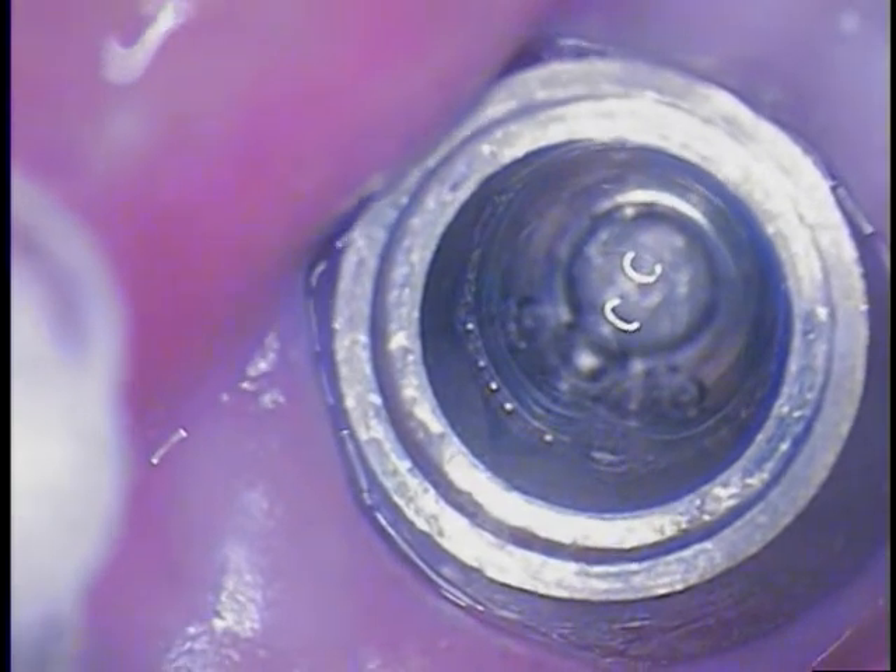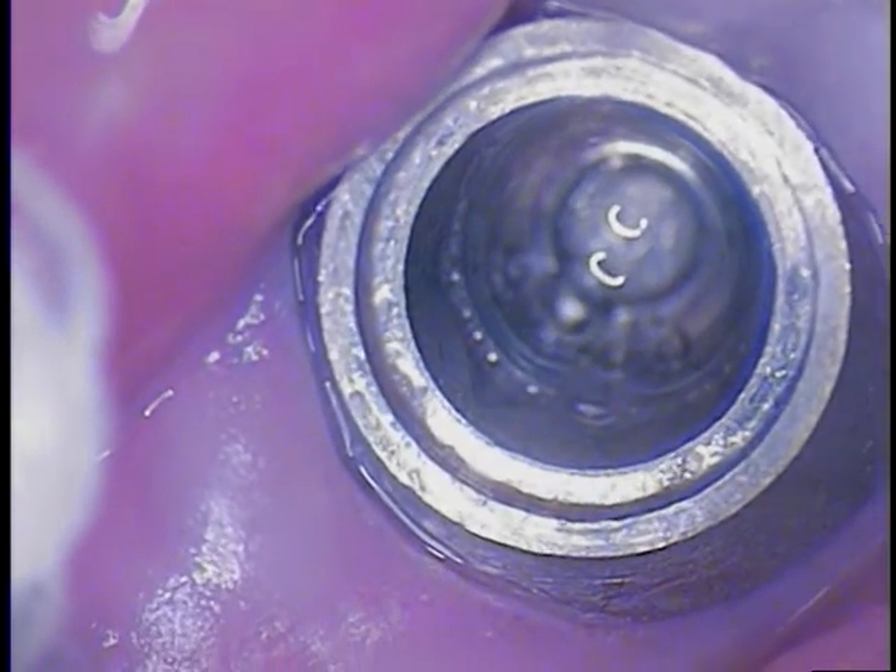So it's going to be a patient waiting game here. I'm going to move to the next segment and speak to my patient first. Dr. Jerry Cuomo with another rescue case with a wide-neck implant.